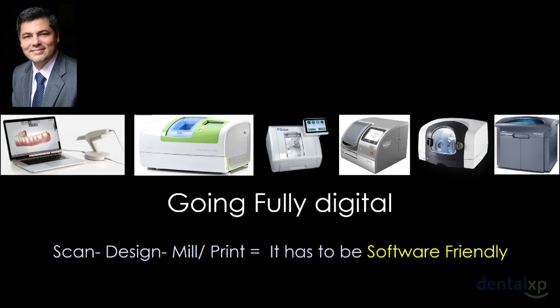So basically, when you walk out of here and you decide to visit the different companies that are presenting these technologies to you, it's not just about what the technology can do for you, but how are you going to deal and cope with the technology? How are you going to be able to play with those devices without getting beaten by the computerized process of doing the work? So it has to flow.